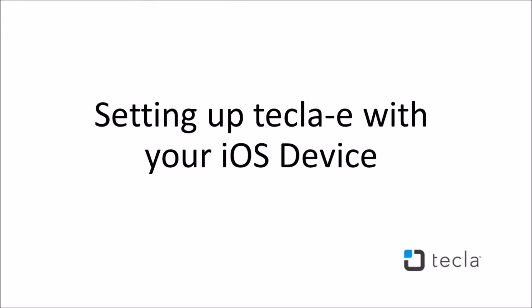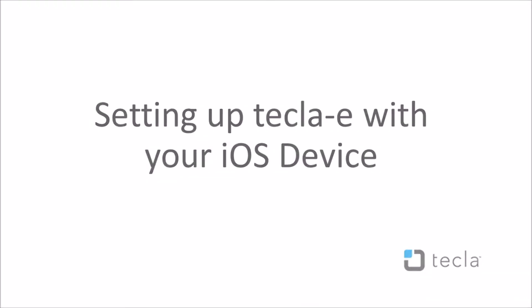In this video, you will learn how to set up your iOS device with Tecla-E. For the purpose of this video, we are using an iPad to do the setup.